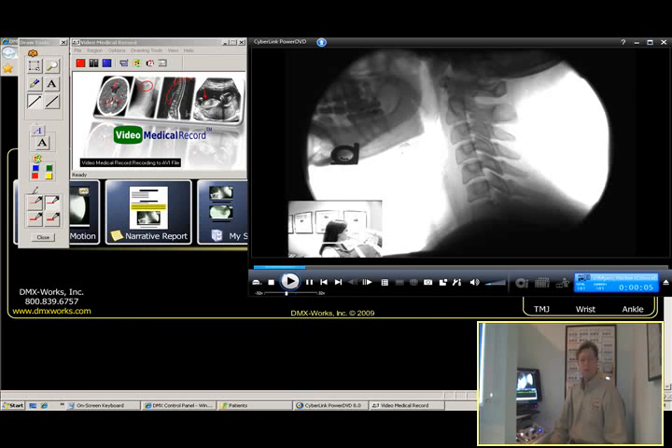Sometimes a written radiological report or even a digital motion x-ray on a disc isn't enough, because not always are the doctors, attorneys, or insurance companies familiar with this type of technology. So we have a new program called Video Medical Records, which allows us to talk over the digital motion x-ray. We're able to draw lines, count down the bones, and actually pinpoint and show where the ligaments have been injured. It's basically as if I would be in someone's computer talking to them as they're watching the motion x-ray — and it's unbelievable.